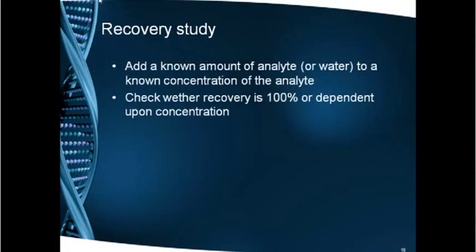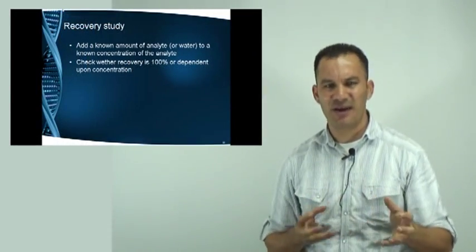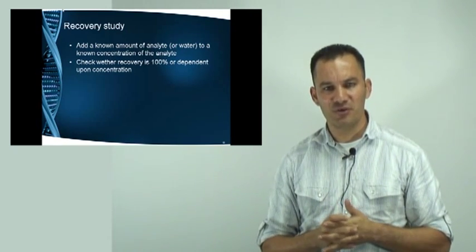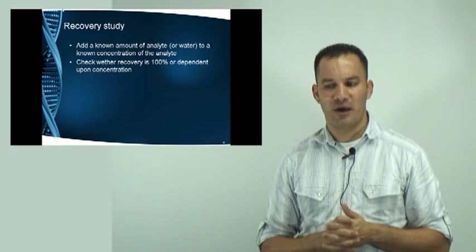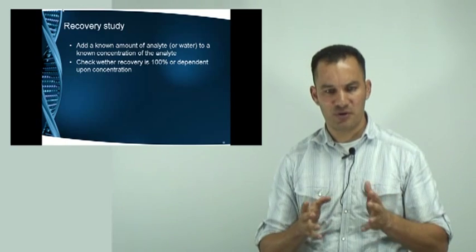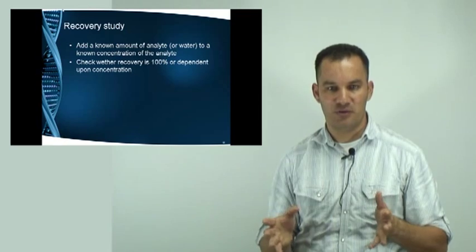Recovery is a study that we usually do if we have an element or an analyte that is commercially available, usually for more complex methods such as hormones or tumor markers. This is a little bit different or difficult, because you cannot use patient samples, I'm sorry, because patient samples have substances in them which will interfere.